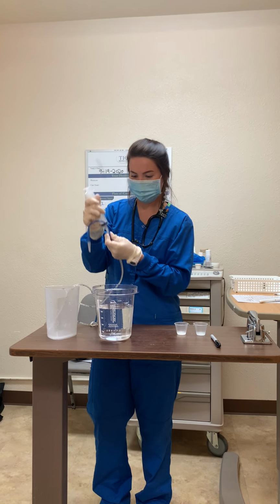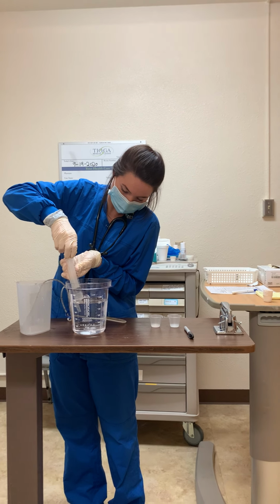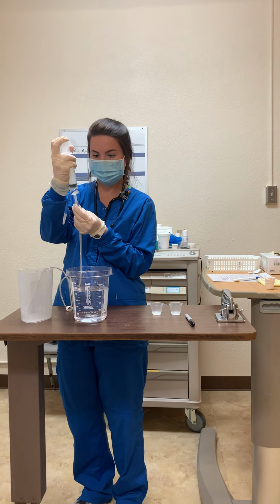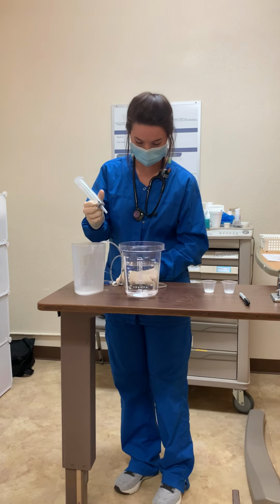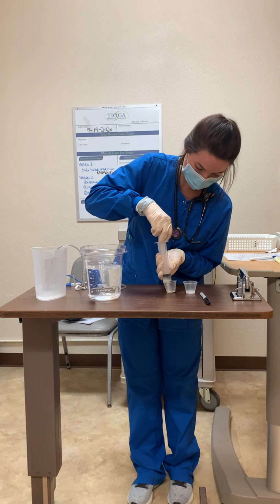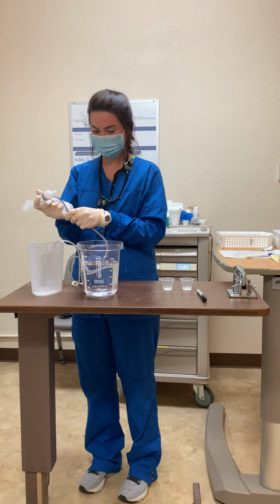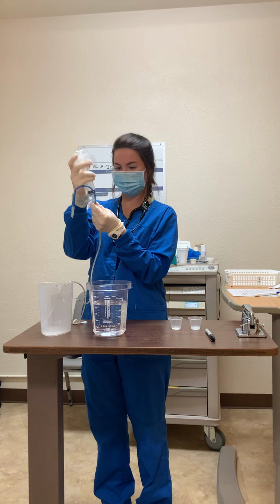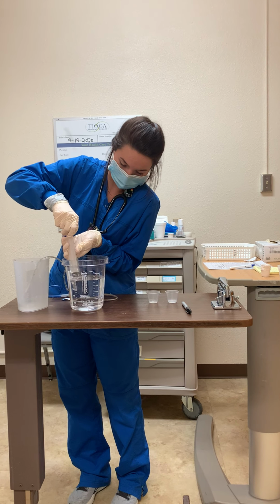Okay, and then between each medication, you want to flush it with about 15 to 20 milliliters of water. And then we want to flush it again. So another 15 mils of water.